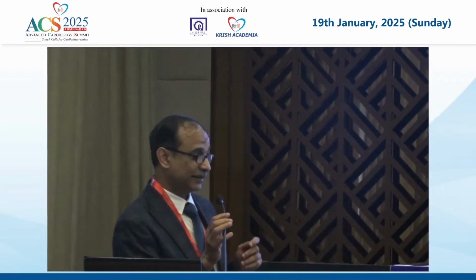So this 6.1% was actually drawn from the US. In India, I'm sure it's less than that also. And this is the situation in the US where it is mandated by the FDA that you cannot address a lesion unless you have proven ischemia. That means if you do not do an FFR or a stress MPI or something, you are not able to intervene in that lesion and not get sued for it. That's the situation in the US. So it's very sad, unfortunately.